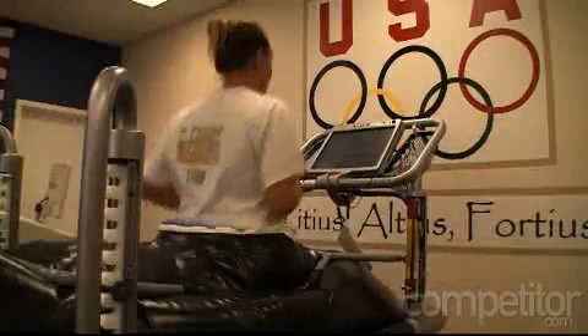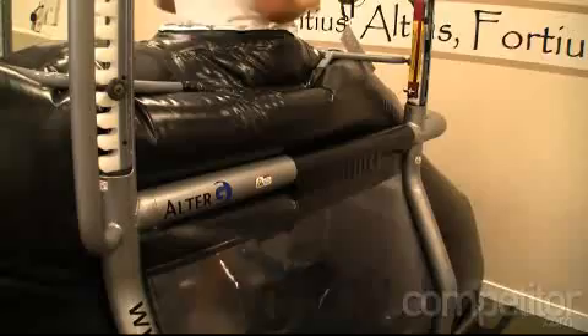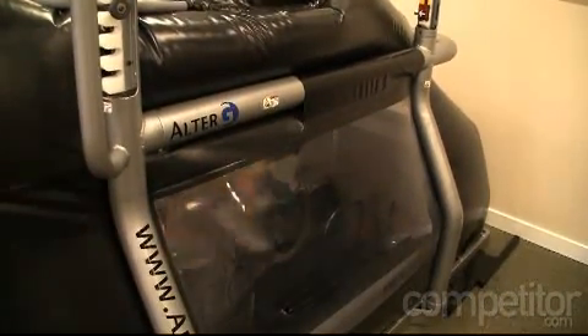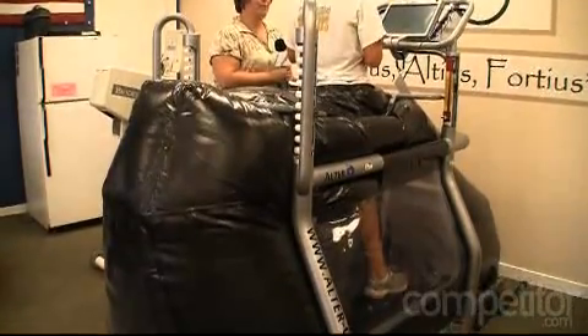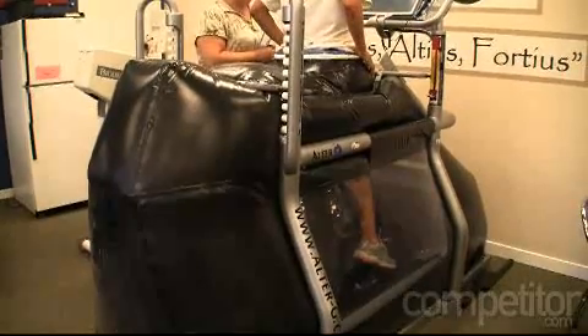It's an amazing tool that we've been able to utilize here at the training center to help actually de-weight our athletes. They can run at a partial weight or even at their full weight, a normal treadmill — it's a body-weight treadmill — underneath a component that basically lifts the athletes up by the shorts so that there's nothing hanging, nothing impeding their normal motion, but it takes up to 80% of the athlete's body weight off.